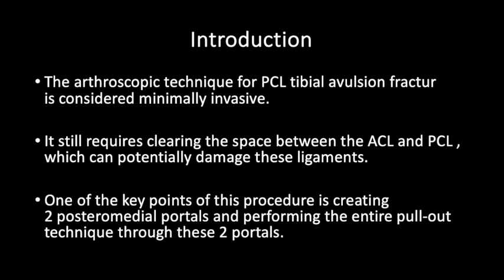One of the key points of this procedure is creating two posteromedial portals and performing the entire pullout technique through these two portals, thus eliminating the need to clear the space between the ACL and PCL.